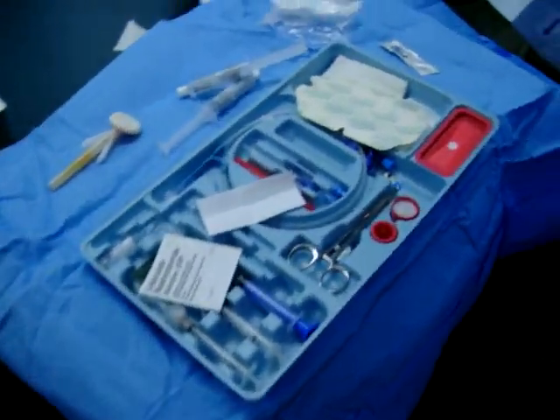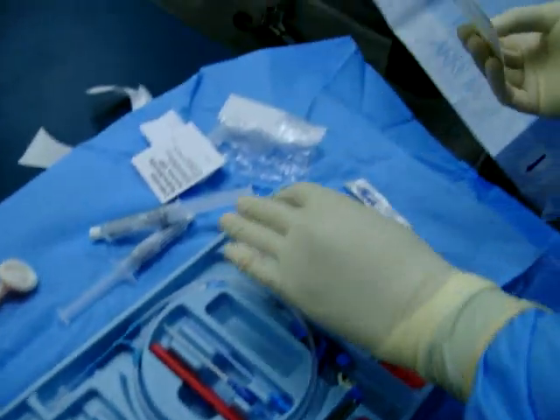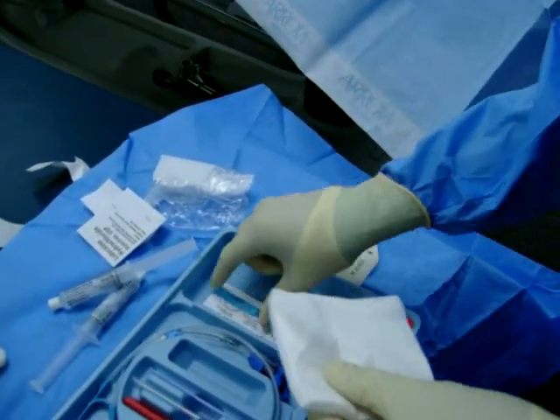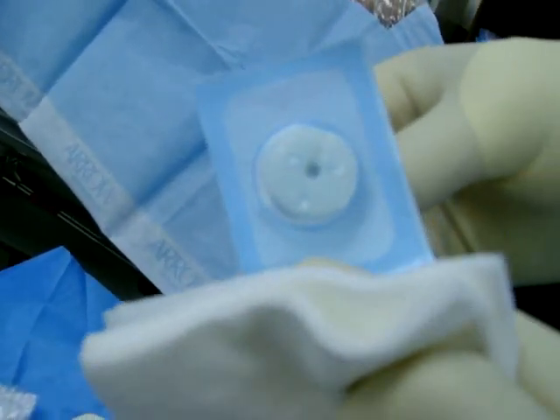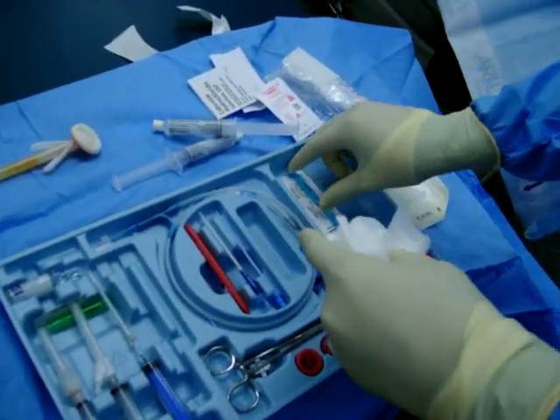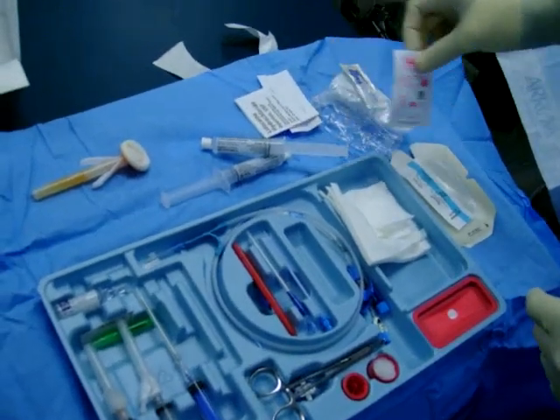In the kit, there are going to be a lot of different things. You can place some items to the side. You're going to need some gauze on your field. Here's a tegaderm for when you're finished. Here's some suture, which you'll need. This is called a biopatch — it's an antibiotic chlorhexidine-laden patch which you put around the central line to prevent infection. I kind of get my sutures and put everything in order — suture and tegaderm together, and biopatch alongside.